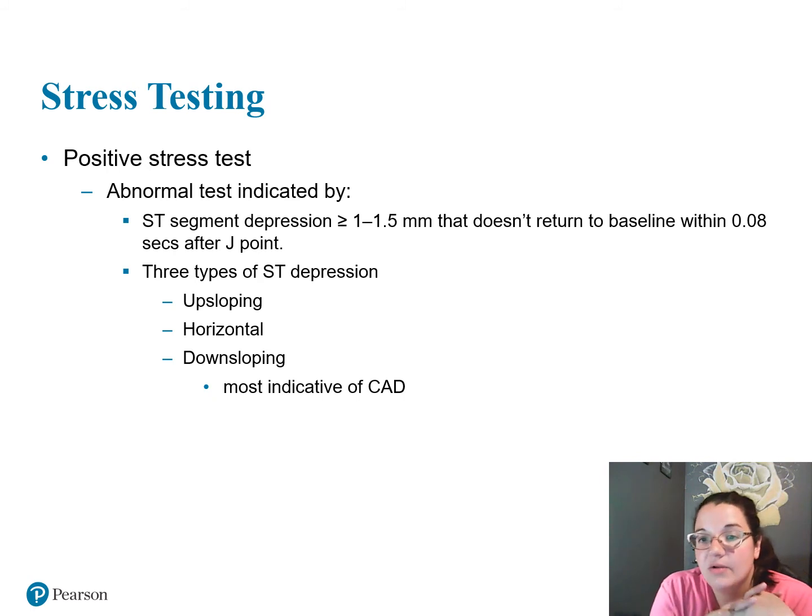So now that we know how to do the test, why we do the test, and when to stop the test, and when to continue the test, now how do we read our test results? So for example, for our Bruce, we're testing that patient, we're recording their heart rate for a total of 21 minutes, right? How do we read a rhythm that's 21 minutes long?